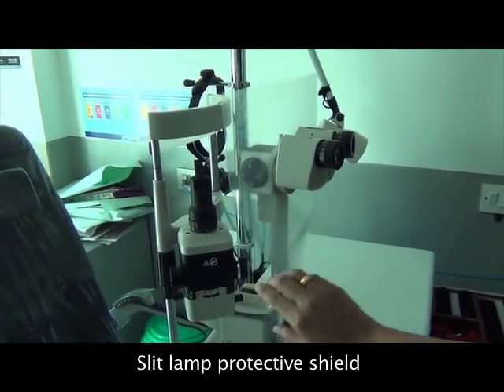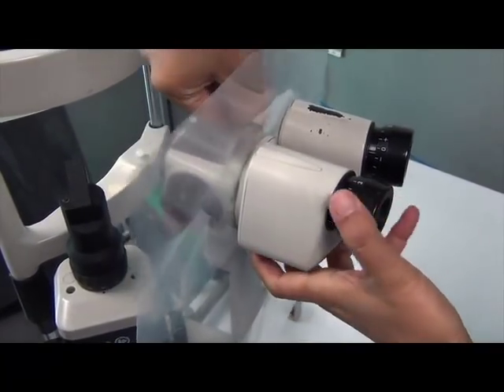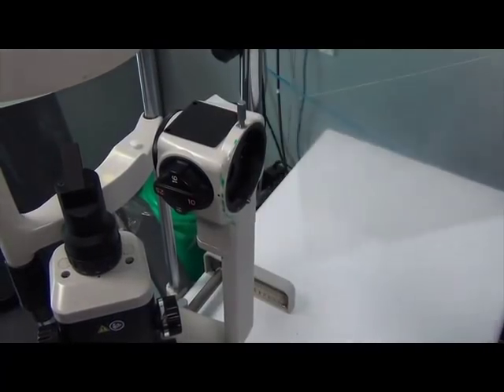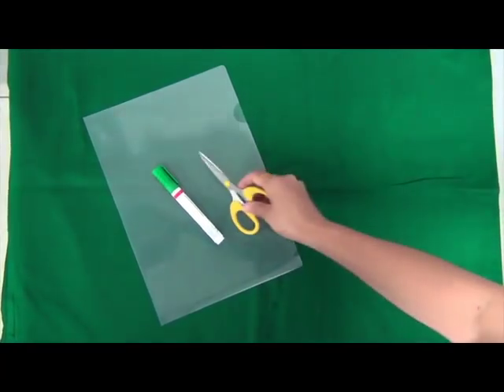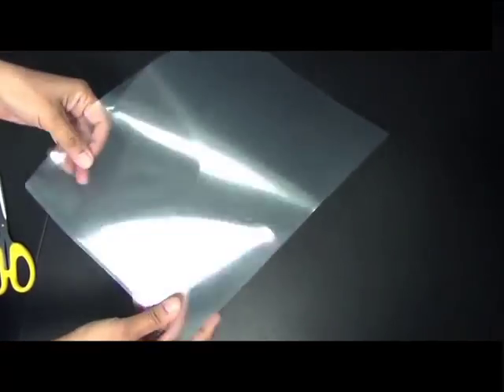This is a slit lamp protective shield that I created out of a simple plastic file, and the reason I used that is because it's a flexible material. I have loosened the screw that connects the eyepiece to the rest of the slit lamp. The materials required are: a simple flexible file folder made of plastic, a marker pen, a scissor, and a blade.